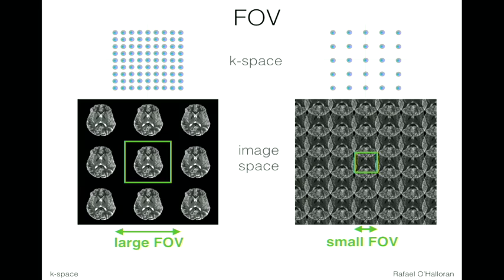And this example here is just meant to show that from the standpoint of the scanner, if you acquire too few of these dots, then what you get is the replicates, which are caused by these infinite stripe patterns. They get closer and closer together, and that's practically what causes the phase wrap. Okay, yeah, we can talk about it more, for sure.